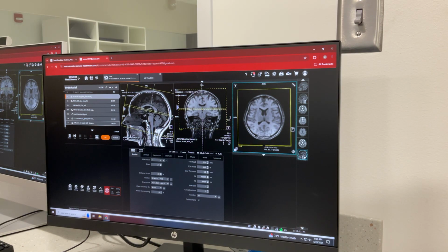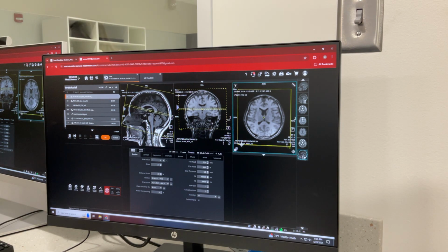That's how you adjust your field of view box. We don't have to hold it down for anything else. So click in this box, and now hold your Alt key down and hover over your field of view box line. Once you get those arrows, you can move that field of view.